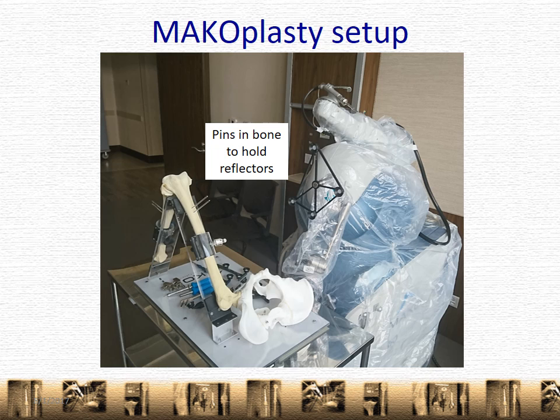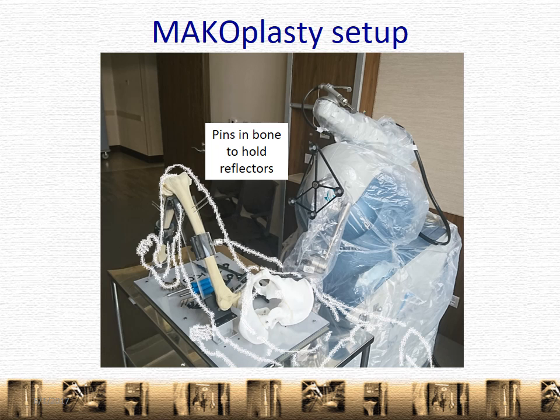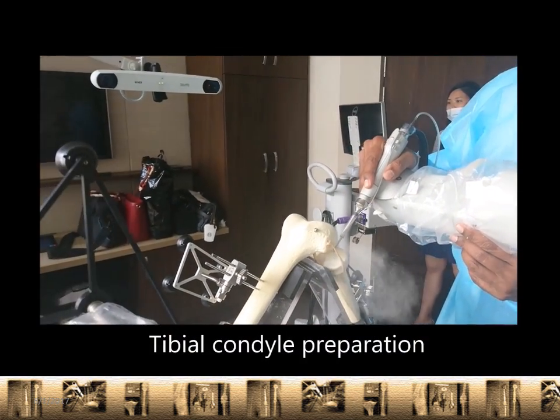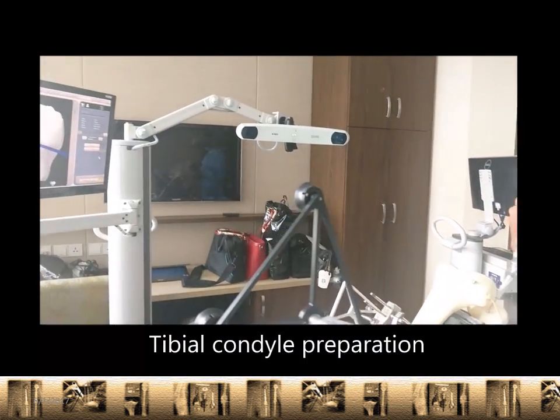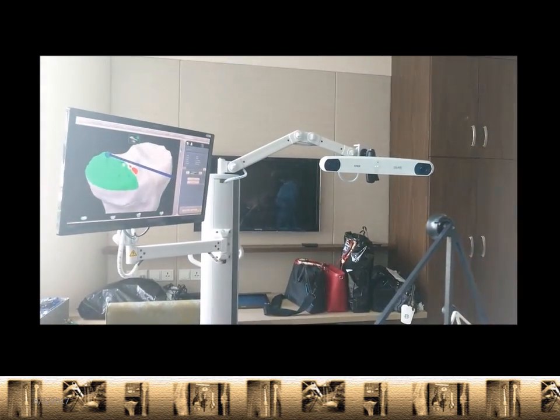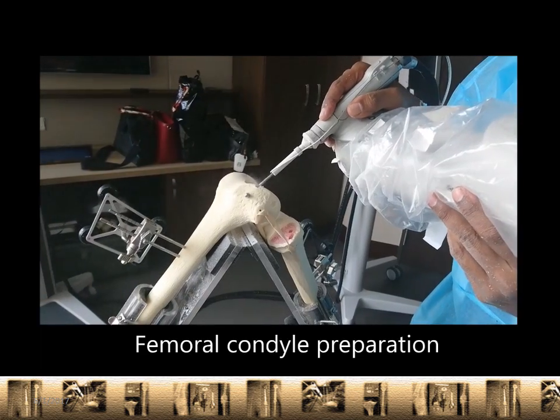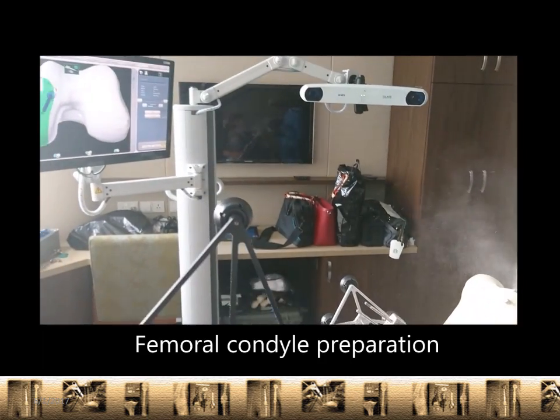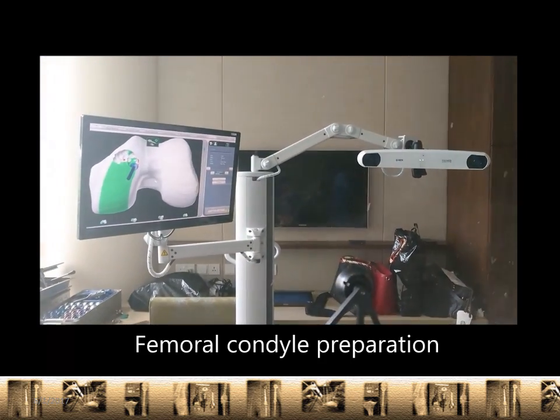This is the pelvis and the femur, or thigh bone, in the practice bones or saw bones. And this would be how a person would be positioned if lying down. So the video is here — immediately you see the tibial condyle preparation. And what should be apparent is there is no cutting; it's actually more of a burring, and we're following that up with the femoral condyle preparation.